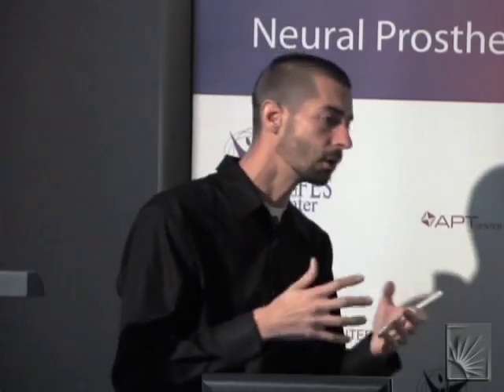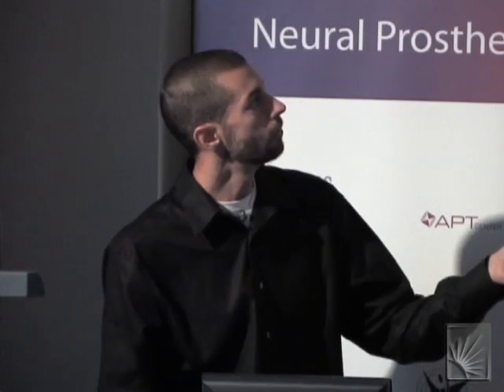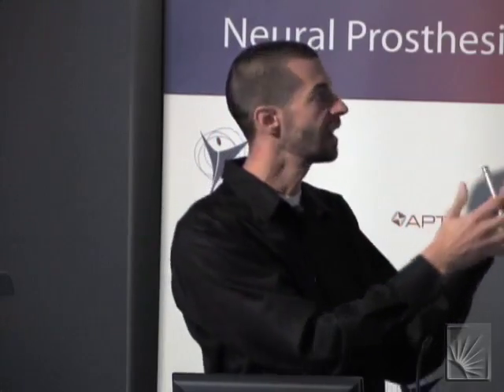Now maybe in the future as these things evolve and become more detailed, we may be able to take people from getting 30 to 40% improvements in their motor scores to 50 to 60%. Maybe if we're titrating it just right, we'll be able to get those benefits. But right now, we don't know. And maybe that's a factor of not being able to make accurate predictions, or maybe it's just that the limit of the system's already been reached.